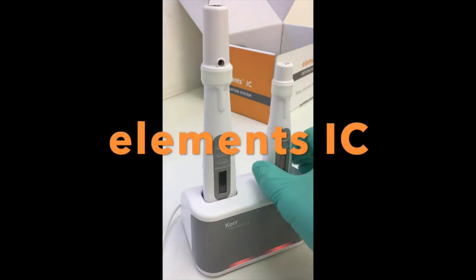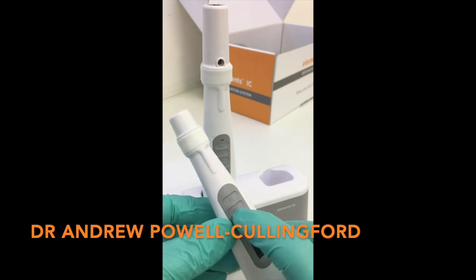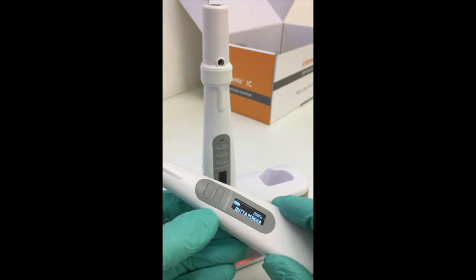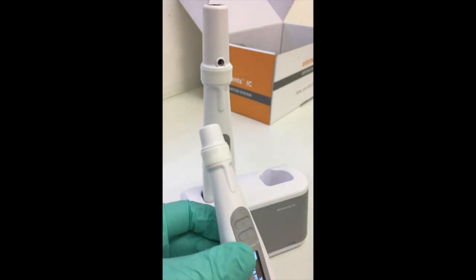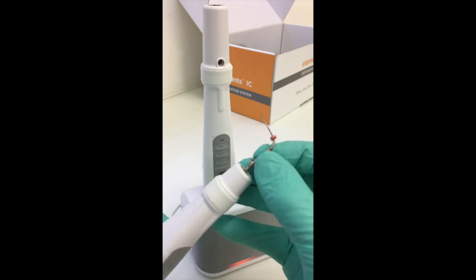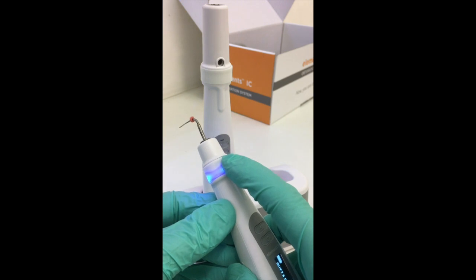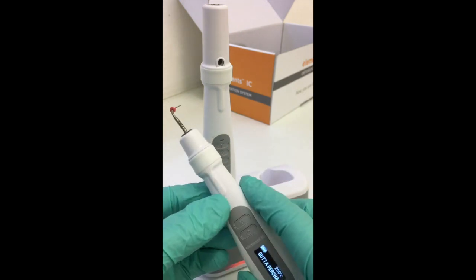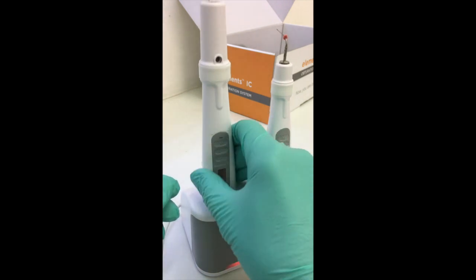Hello and welcome to this short video produced by Dr. Andrew Powell-Cullingford, looking at the benefits and advantages of the new IC Elements Obturation System. As you can see, it looks very similar to our original unit. Here we have the System B plugger tip placed into the unit, and we have a 360-degree touch unit which is very practical.